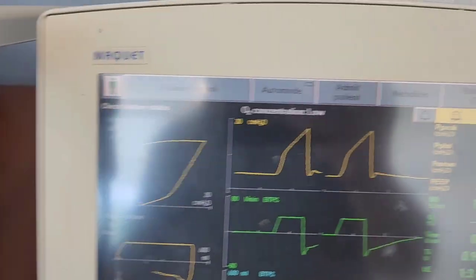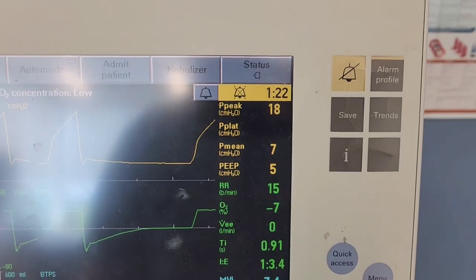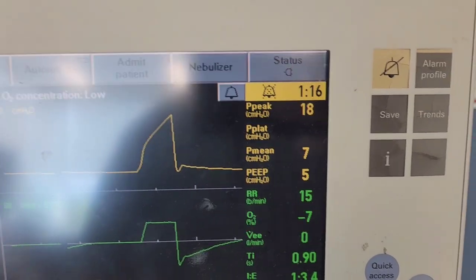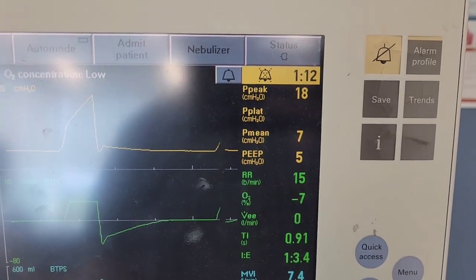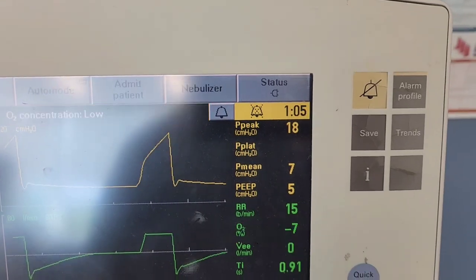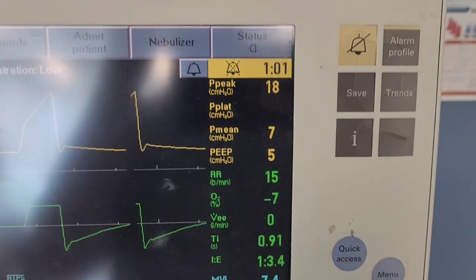Okay, let's see what happened to compliance. Remember, peak inspiratory pressures were 14 with no resistance and no compliance issues. And it went up a little bit, but let's look at plateau pressures. Remember that one gradually went up to 12, then it went up to 20, 21 or something like that, and then up to 30. But it started going up.